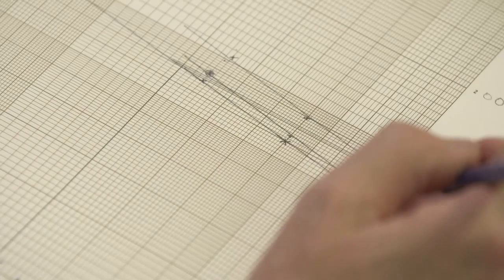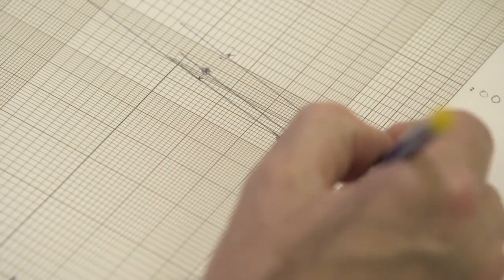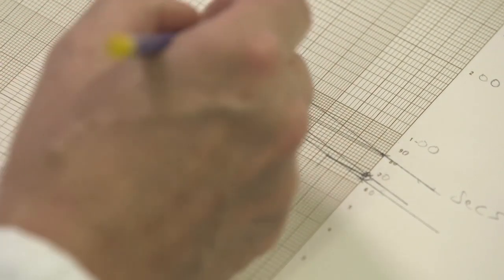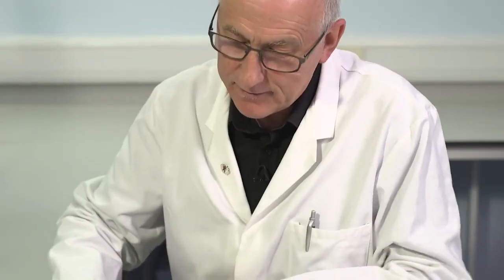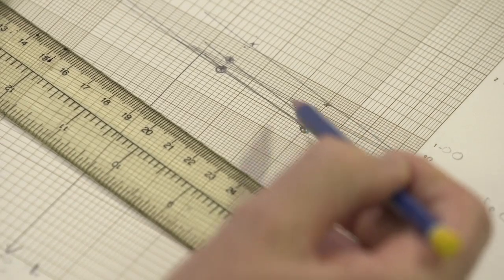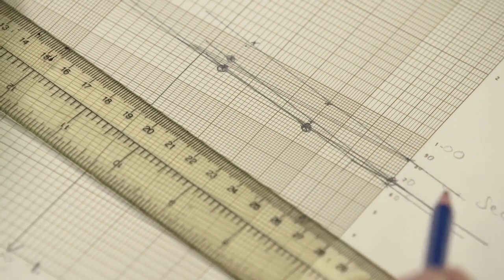Next patient, 1 in 10 dilution, 67 seconds. 1 in 20 dilution, 70 seconds. Here. 1 in 40 dilution, 78 seconds. Here. So now we have 3 points. It is a straight line, but it's not parallel to the standard. Here is above, and here on or below the line. Straight line relationship, not parallel to the standard.